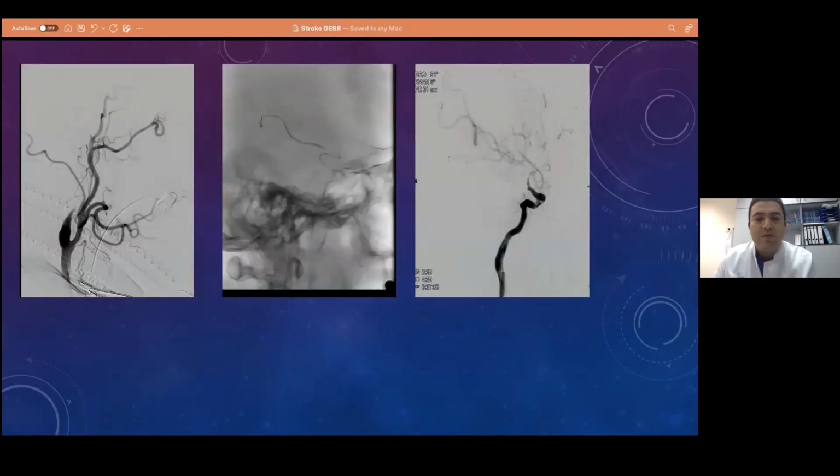I took him to the angiography suite, and he also had an internal carotid here, also thrombosed at the beginning, and I passed it. And here's a confirmation that it's still intraluminal. The middle cerebral artery is contrasted. And this was after the first maneuver of thrombectomy. You still see here maybe a thrombosed part, and here in the cavernous segment, it doesn't really look well.